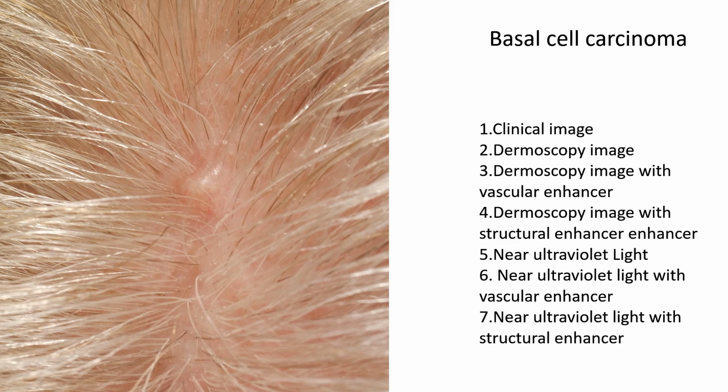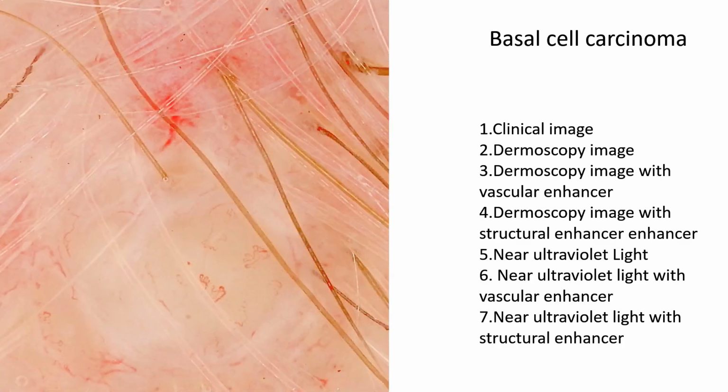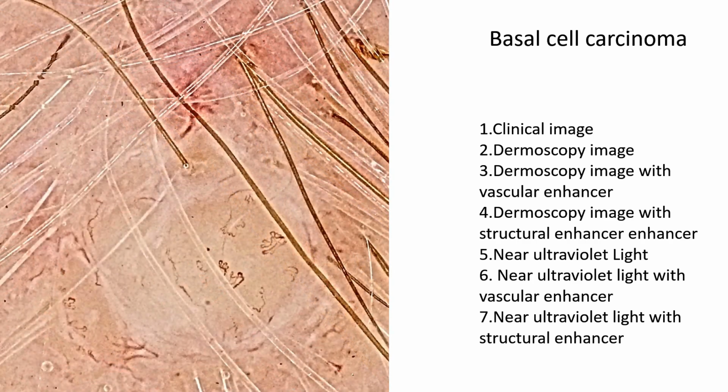Lesion on the scalp. Could this be a cyst? Well, dermoscopically, you have these very fine vessels in this milky white area. Not an easy diagnosis. With the vascular enhancer, you see them somewhat more prominently. And with the structural enhancer, you see them even better.